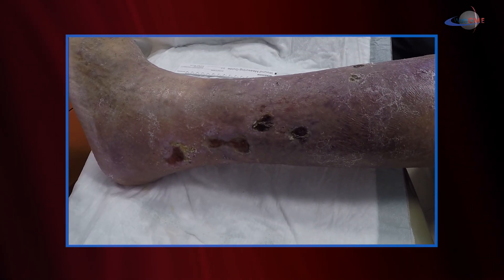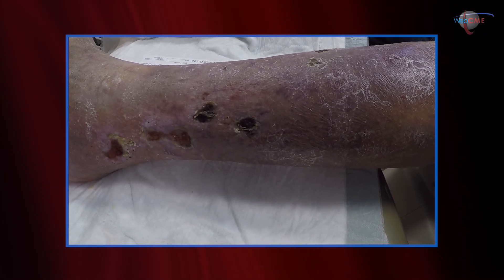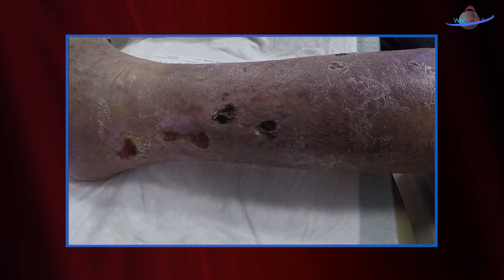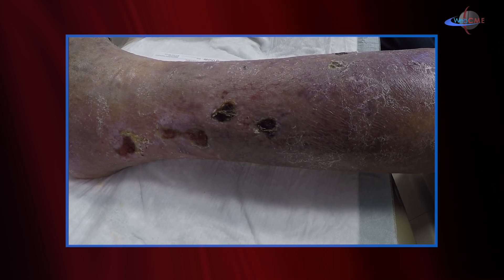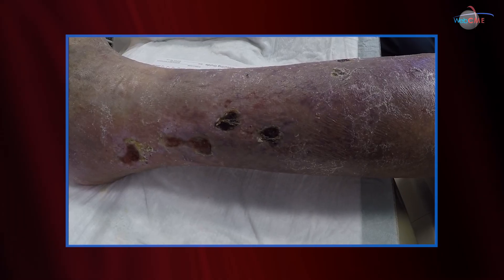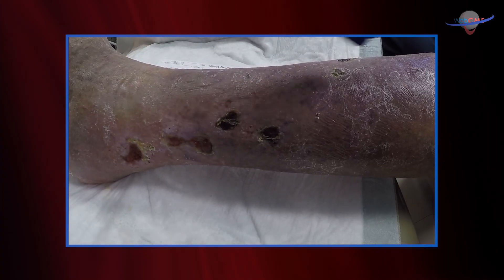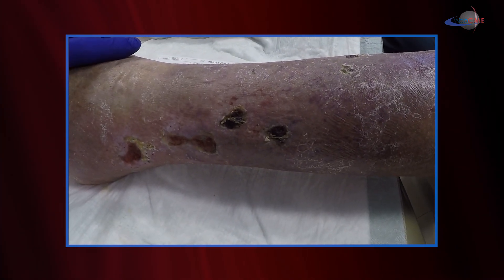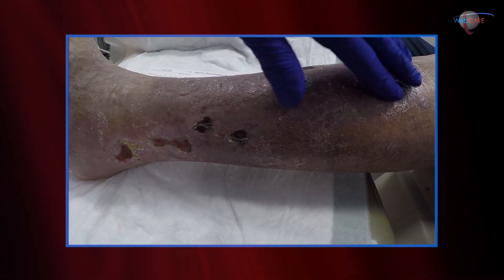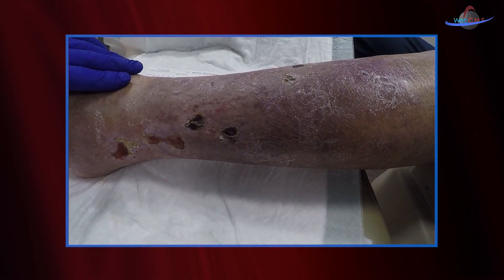This patient presented with severe venous insufficiency and had multiple wounds that we've been managing. They've been responding well to our efforts with compression. The primary mode of treatment was treating his underlying venous insufficiency, which was accomplished through a series of superficial venous ablation procedures as well as sclerotherapy at the ACH Vascular Center right next door. We have gotten his venous insufficiency well under control. You'll notice very minimal swelling and the tissue is in pretty good shape. Some of the hemosiderin staining that was very prominent has actually started to resolve, which is very impressive.